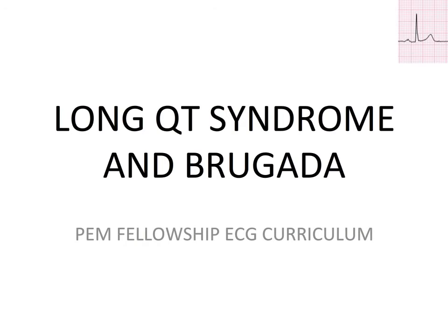Welcome back to the PEM Fellowship EKG curriculum. Our topic today is long QT syndrome and Brugada. Remember that you can always refer back to the basics module if you have any questions, and that you should pause this module if you need more time to review the EKGs shown.